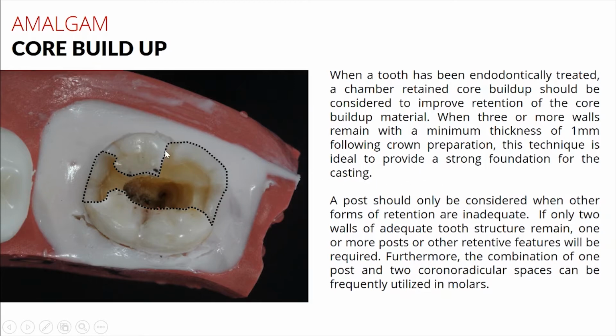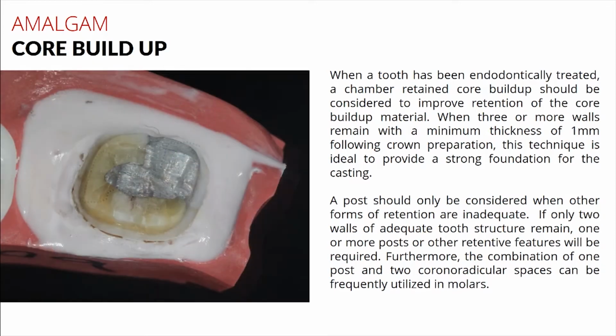In this case, they call it a casting. If you can see here, this current tooth has sufficient walls so that if we put something in here, there's not really a path in which that material can be easily dislodged. The other thing that's to our advantage is that we can stuff some of that material down into the chamber, which also acts as retentive features to prevent dislodgement of that core material.